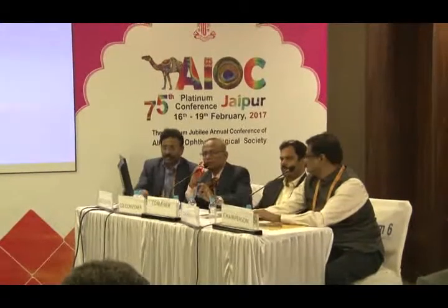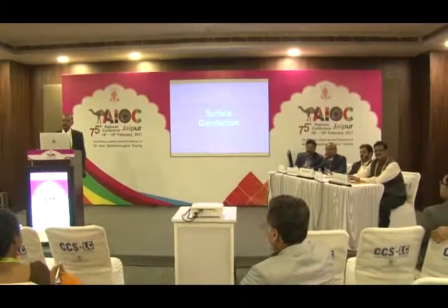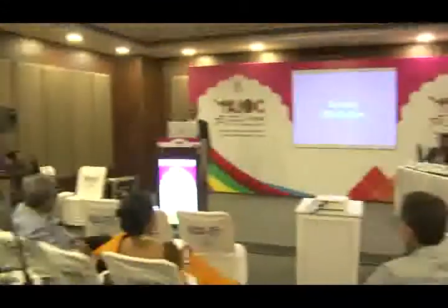Excuse me, sir. You just showed that AquaGuard water is used. Can it be used? The final wash should be with filtered water, either AquaGuard or boiled and cooled water. AquaGuard can be used. Where I operate, we don't have AquaGuard, so the last wash I do is with a saline bottle. Sterile saline. That's sterile, okay, that's good.